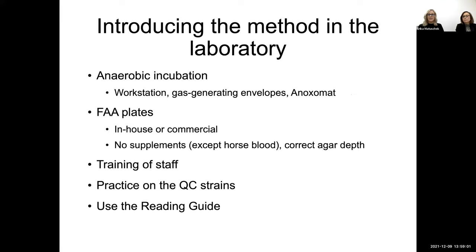Oh, wonderful. And the other thing we did, Audrey, was that we took the QC strains and mixed them into the collection of isolates that the labs that were part of the phase one trial were supposed to test as blind isolates. So they got the QC strains as QC strains, but they also got them as clinical strains. So we could compare what the results were on the QC strains when they tested them as QC strains, but also what the results were if they tested them as clinical strains, because all the strains were blinded to them. So they just got number 1, 2, 3, 4, 5, 6, et cetera. So therefore we have a pretty good take on their accuracy and reproducibility.